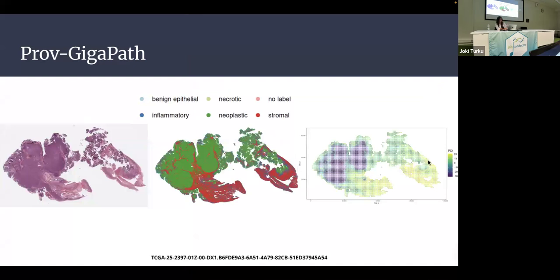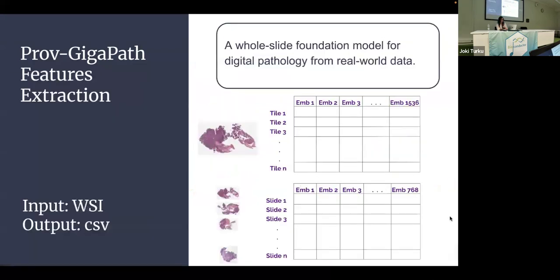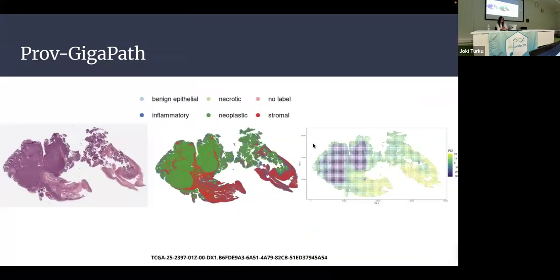So that's something that I'm going to do now in R. We have our raw images, the Overnet output, and then this is the Prov-GigaPath output. We're just going to compute the principal component analysis of our slide level embeddings, on these matrices, like the tile level embeddings. And then we are going to reconstruct these images without the real images, but with Prov-GigaPath. You can see also that the color of the loadings of the PC1 tends to represent the same information provided by Overnet.